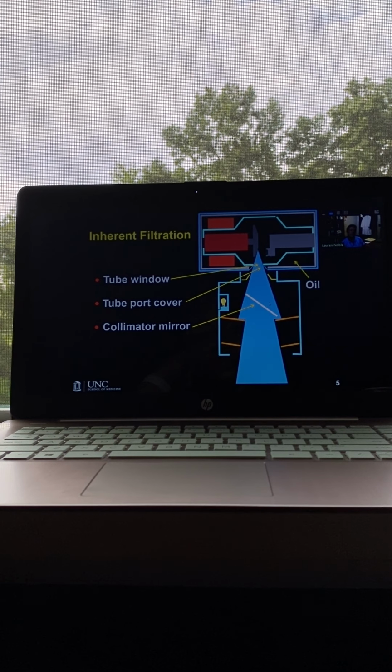By the way, do you know why this mirror is here? It's a mirror. So right in the middle of the collimator, there's a mirror. Is that to reflect the light source of the collimator? Yeah, exactly. And we'll talk about beam restriction on Wednesday.